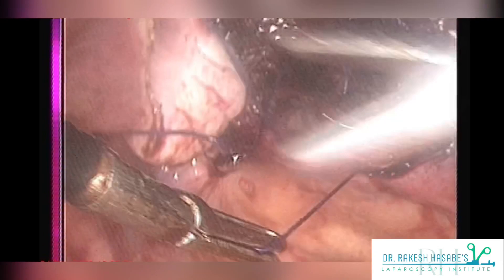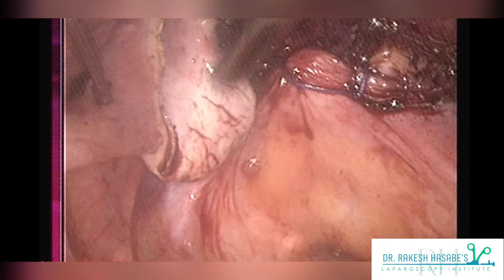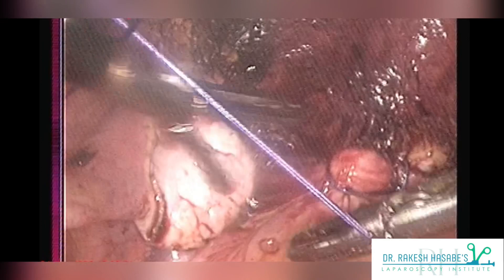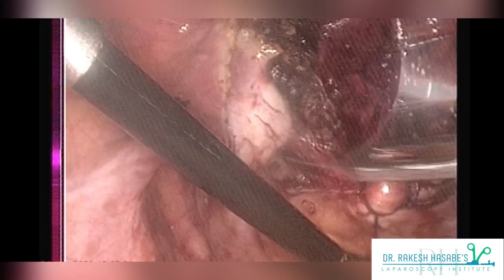Peritoneum per se is not important for preventing future vault prolapse, but it decreases bleeding by pressure effect and also reduces the raw surface area, which will further decrease adhesions. You can ask your assistant to hold the thread and lift the vault, which will make your job easy.